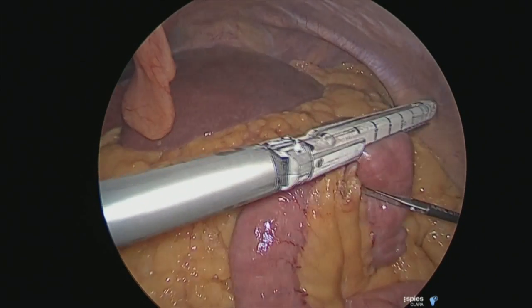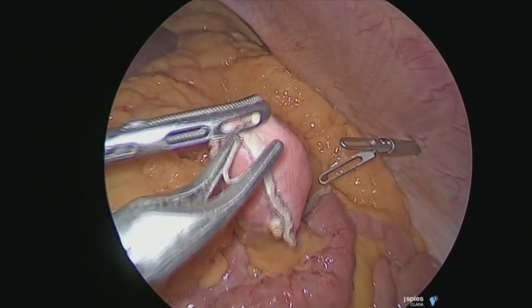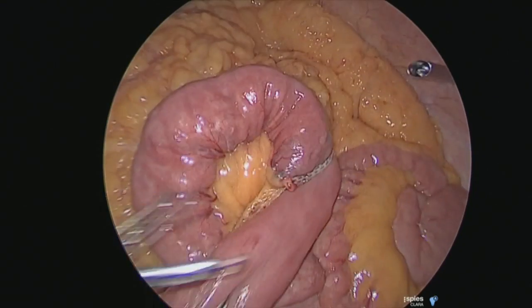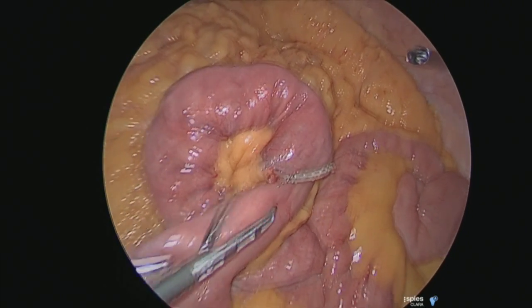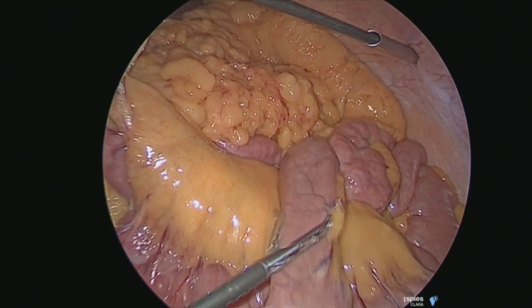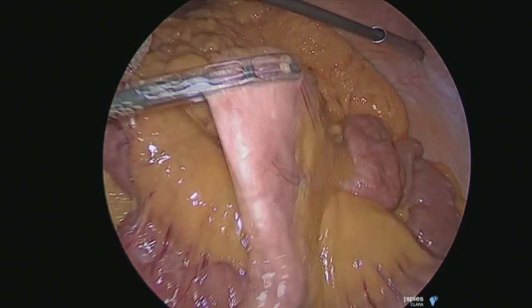You hold on for around 15 seconds to make sure there's no bleeding. You then put a clip to identify the biliopancreatic limb from the alimentary limb — always consistently putting it on either of the limbs which you're used to. I usually put it on the alimentary limb.